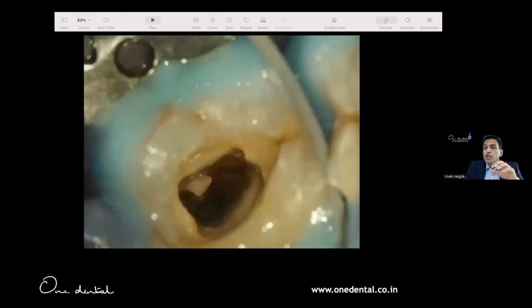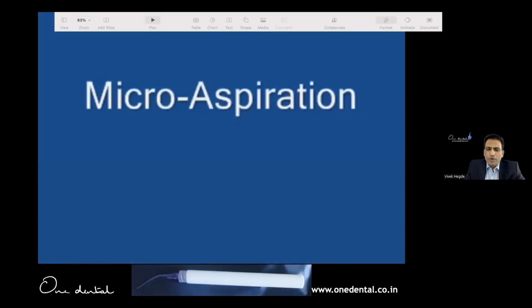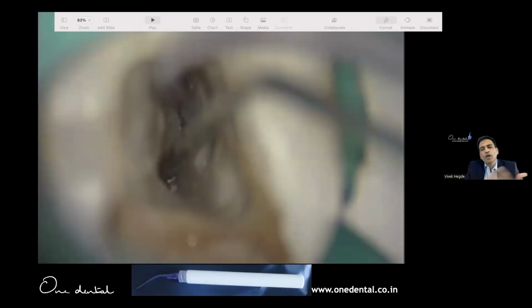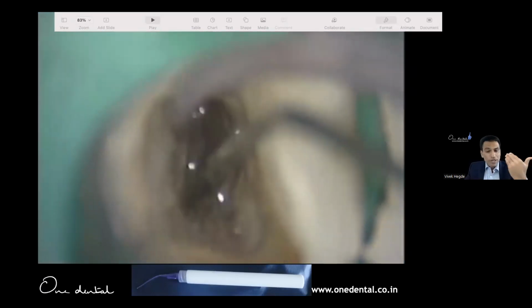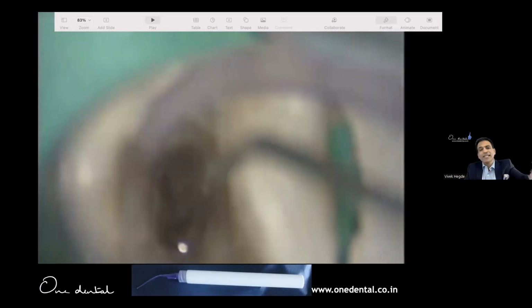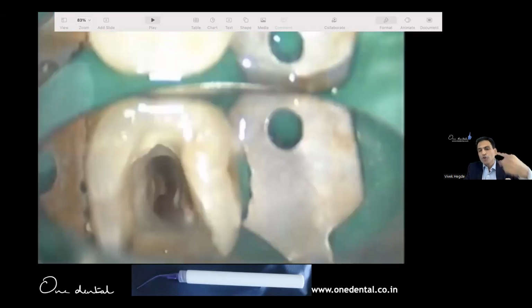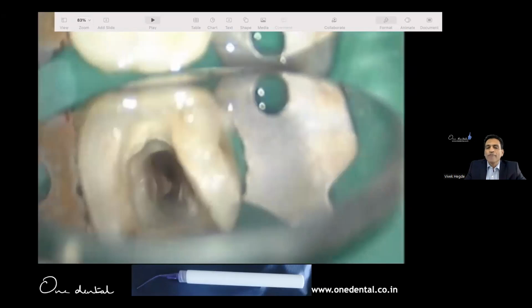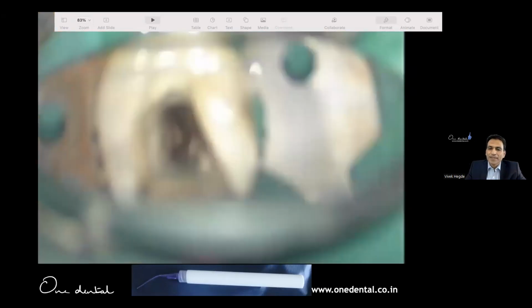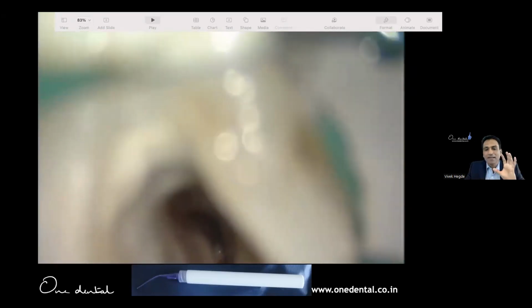By doing this, you need fewer paper points. If you can have a microsuction, another C-shaped canal, see this. It's one of my old videos. I started from here. This is about 15 years old video. One of the old microscopes. So if you see the quality of the image is old. But I wanted to tell you that I have started then. All my assistant does is lock a microsuction needle and hold it there, and see how the suction happens. And I'm depositing solution in a constant flow every few minutes and seconds. And you get a clean system. There's no rocket science. It's a very fundamental, simple system.